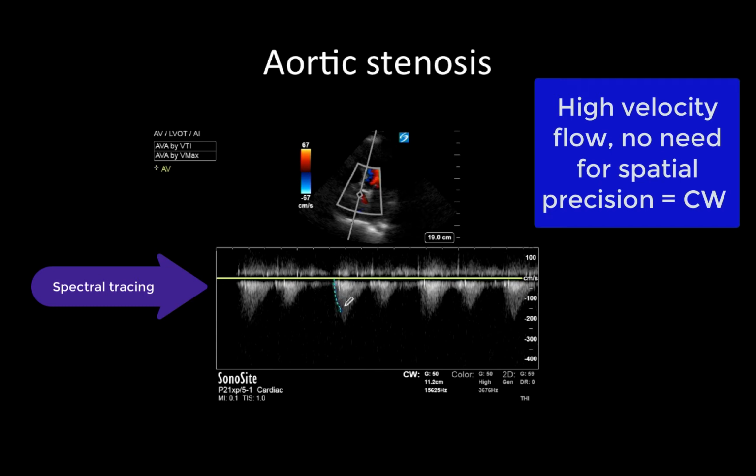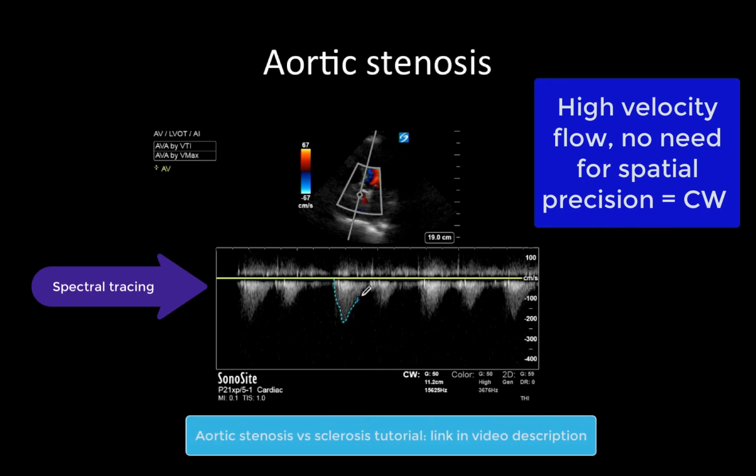And if you want more on how to use Doppler to distinguish aortic stenosis from aortic sclerosis, see the short screencast that's linked in the video description that's posted on the Western Sono page.